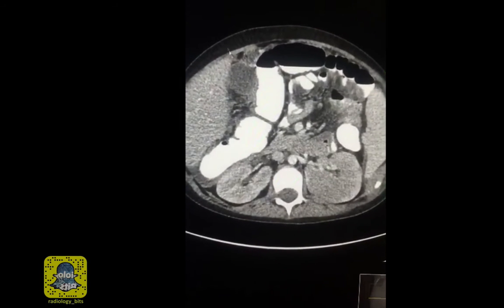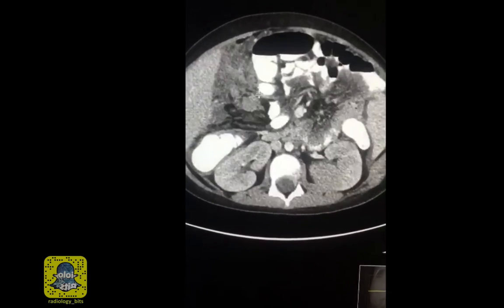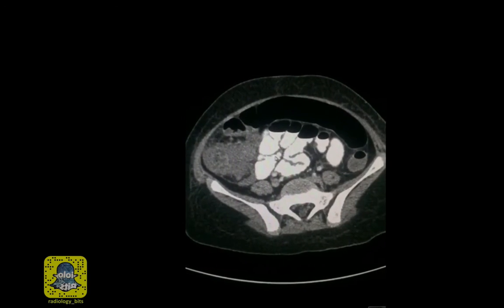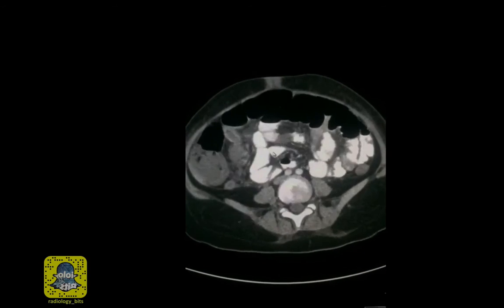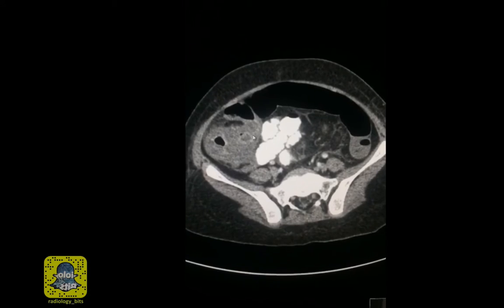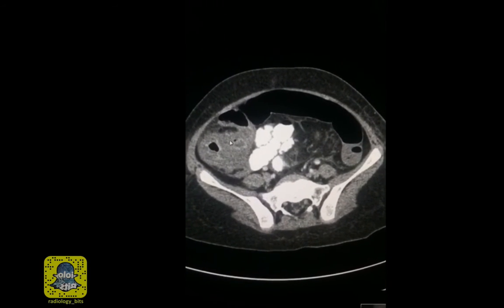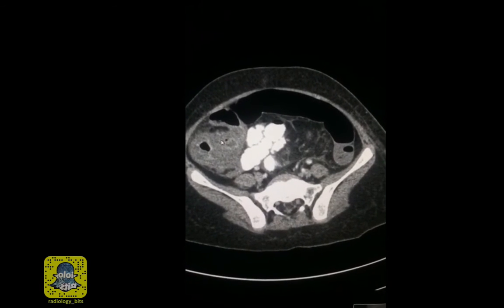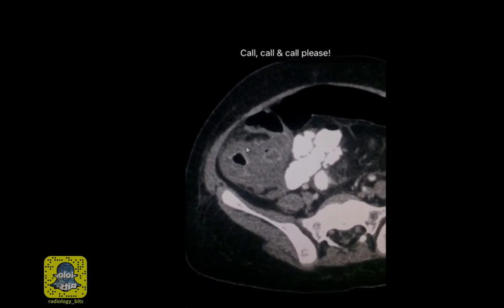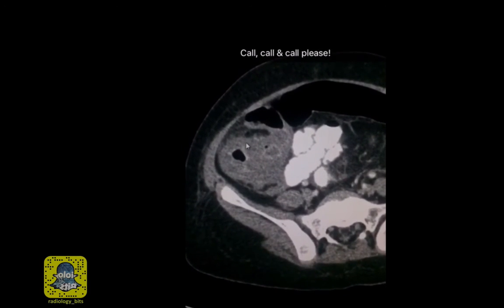Remember to check the omentum, the mesentery, and peritoneal reflections on every case, since malignancies such as lymphoma could involve these structures. Lymphoma, in many cases, could be highly responsive to chemotherapy. And finally, if you see inflammation of the right-sided colon, in particular the cecum, in a neutropenic patient, you should raise the possibility of typhlitis. When that's the case, call the referring physician immediately, since typhlitis is a medical emergency.